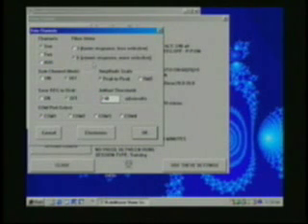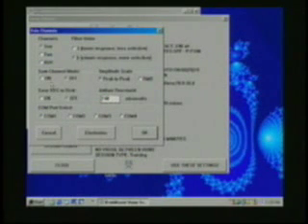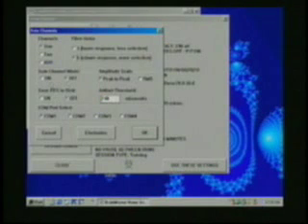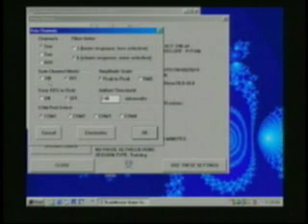Sixth is a slower response but it's more selective and it's appropriate for advanced users. Then we have the sum channel mode which is normally turned off. When you turn it on, the EEG channels are added together which is useful for certain types of synchrony training.